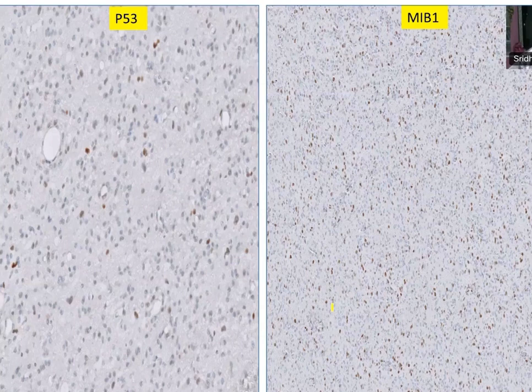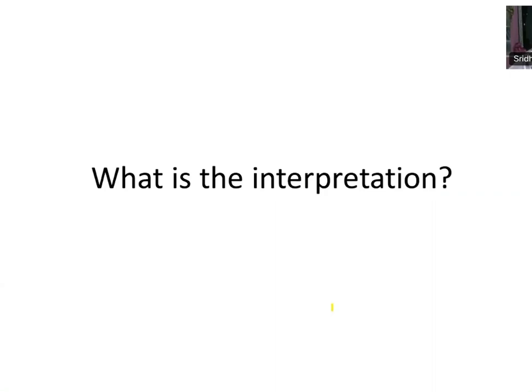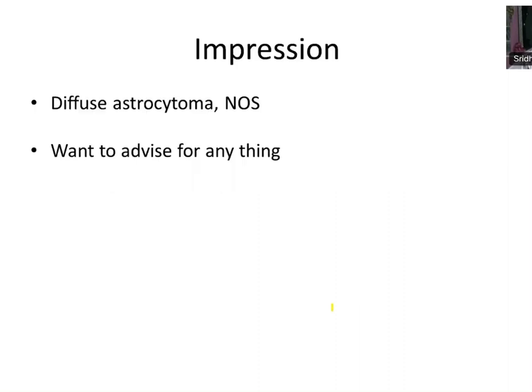So what is it? If you have to investigate further for a glioblastoma, what are the molecular markers you have read? EGFR, TERT promoter mutation, or combined gains of chromosome 7 and loss of 10. Okay. So at this point, you want to do IDH mutation studies. If it is negative, you can safely say it is glioblastoma-like, with supportive marker reinforcement.